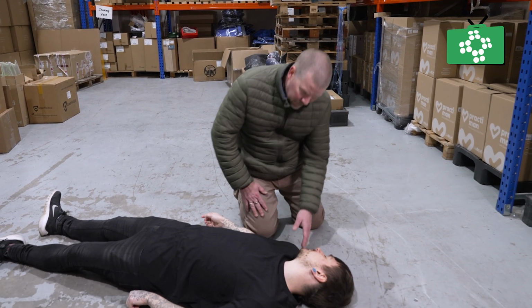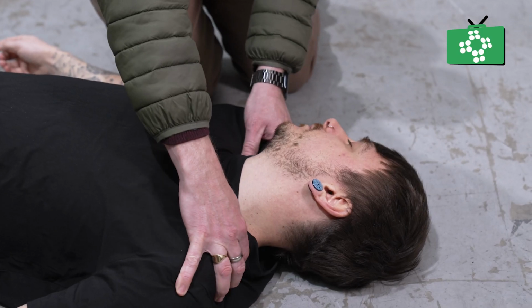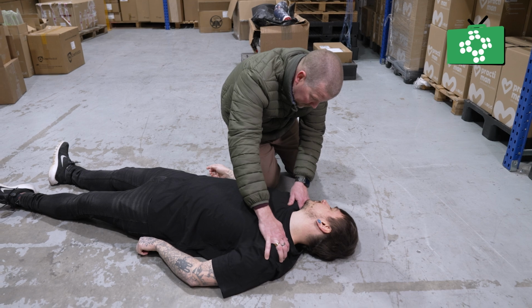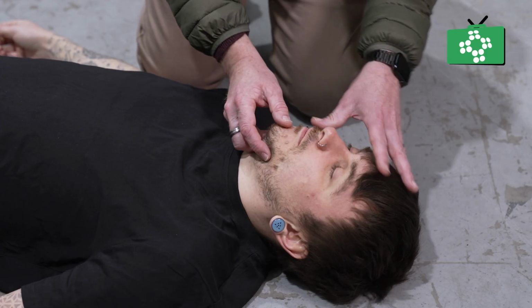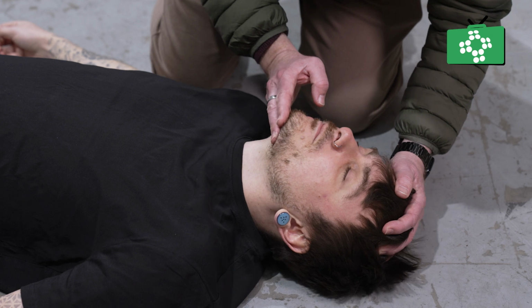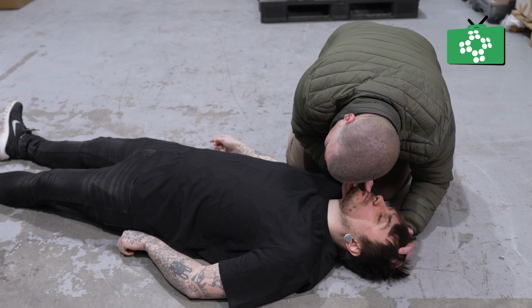Once you're sure it's safe, the next stage is to assess the patient as you learned in CPR training. Try and get a response by speaking loudly and gently shaking their shoulders. Open the airway, check for obstructions and do a breathing check for 10 seconds. If they're not breathing or breathing abnormally, begin CPR immediately.